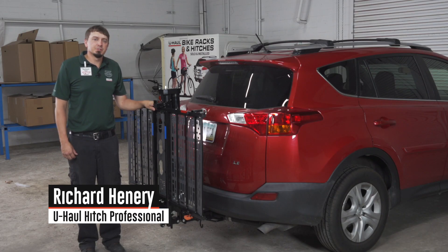Hey guys, I'm Richard. I'm here today to show you how to install a power wire to your electric wheelchair lift. Let's go ahead and break this down.